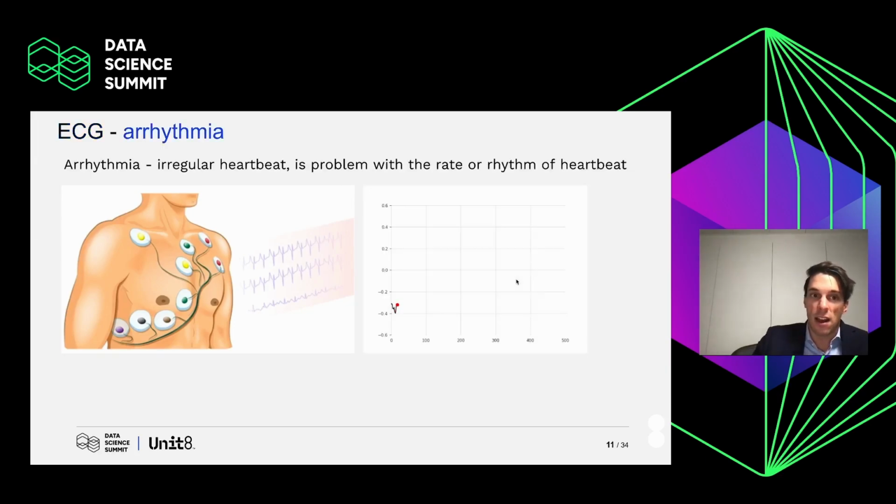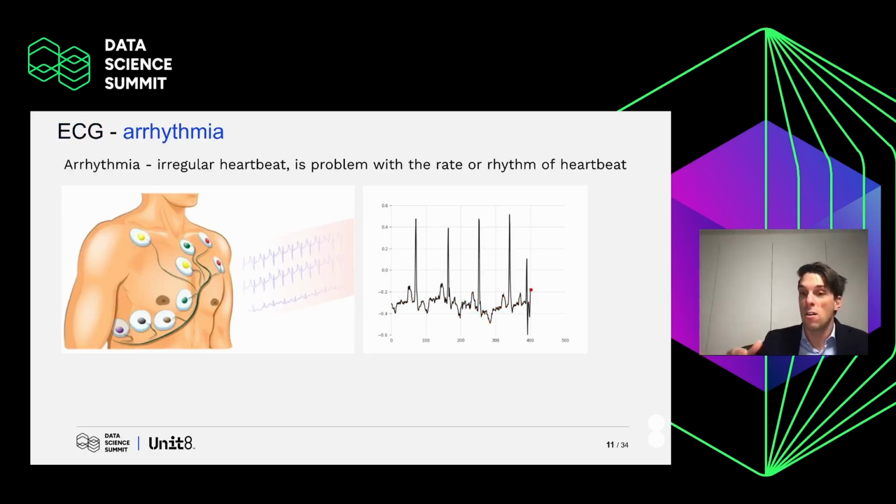An anomaly occurs, which we're going to call in this case arrhythmia, an irregular heartbeat, when the frequency, the rate, is off. As we've seen in this demonstration, the first few peaks followed in a quite regular manner, and after the fourth one there is an arrhythmia, which mostly presents as a QRS complex with a premature spike followed by a delayed secondary spike. These are the anomalies we're going to try to capture in the upcoming exercise and develop a model for.